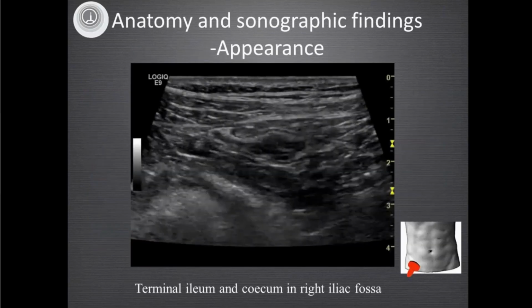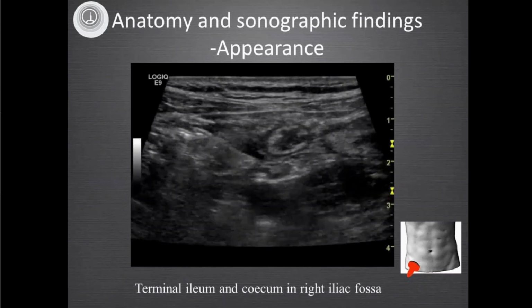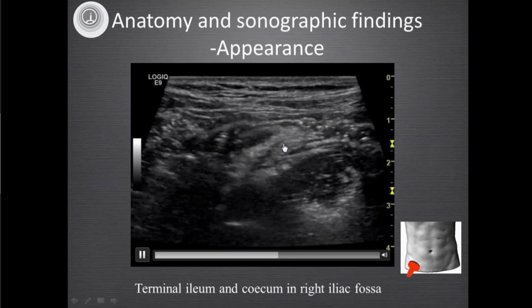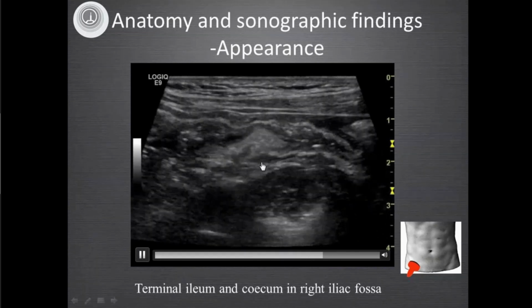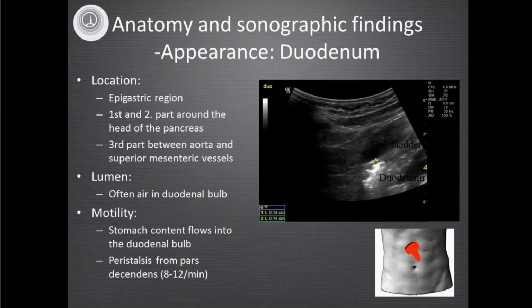Now to how it looks. How does it look, the bowel, when you look at it? This is a nice scan going through the terminal ileum to the cecum, through the ileocecal valve and to the cecum. And very often we make images like that, but obviously it varies.